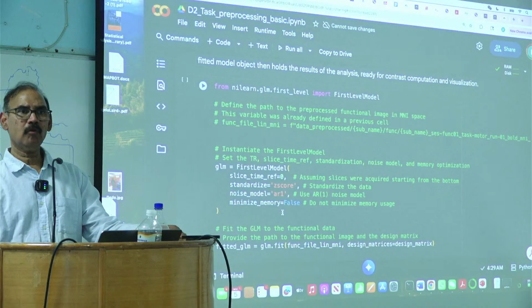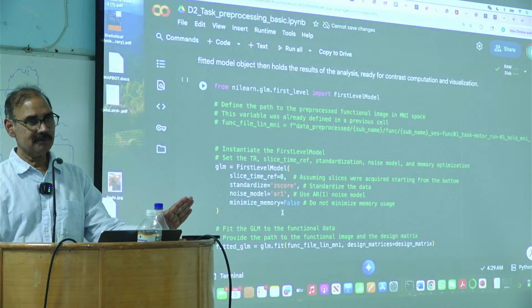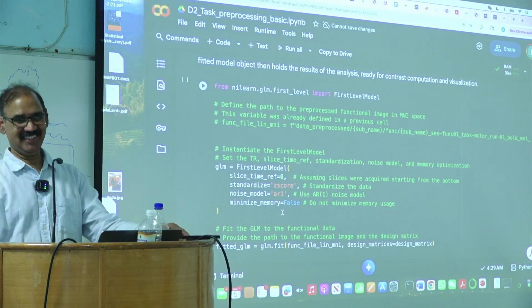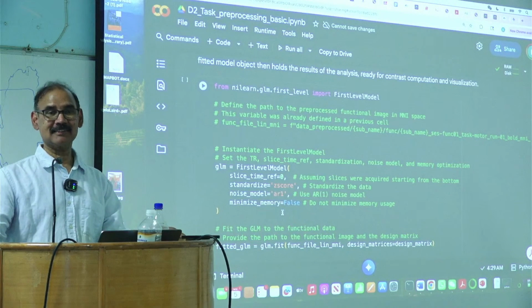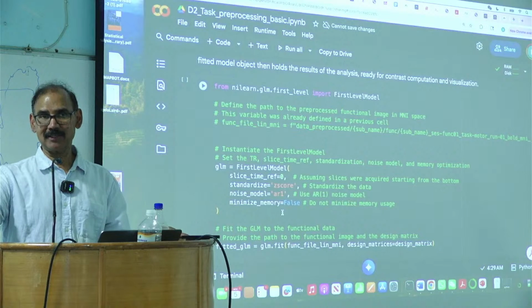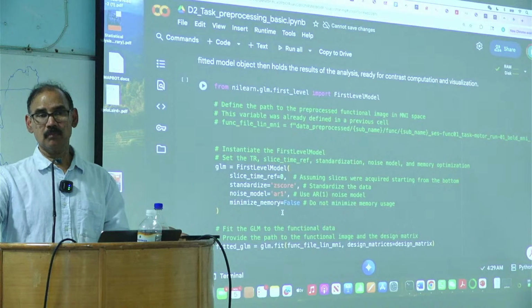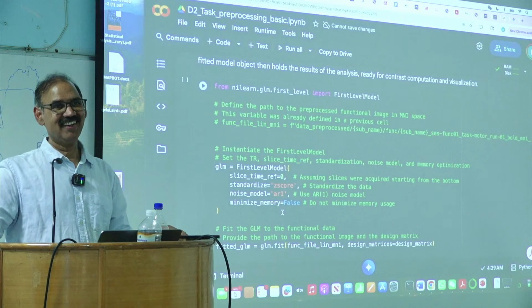Does anyone know what autoregressive noise is? Joshua? I heard from 2 people you're the smartest person in the class. No, pre-whitening, right? So what is autoregressive? Did you say?